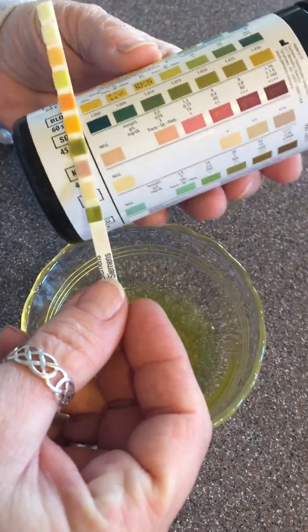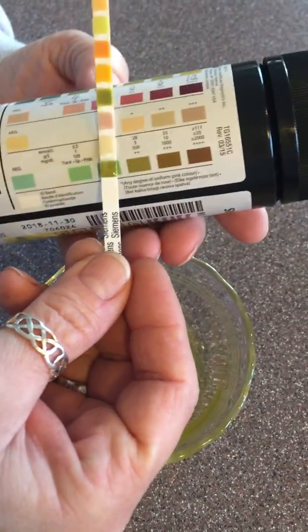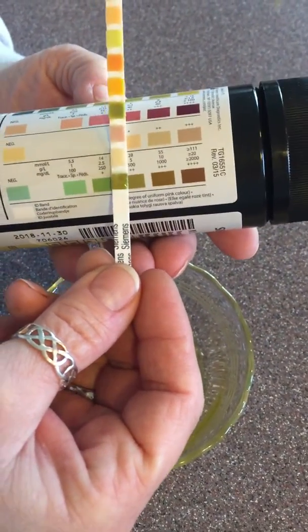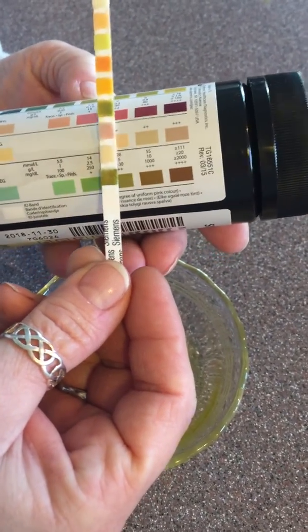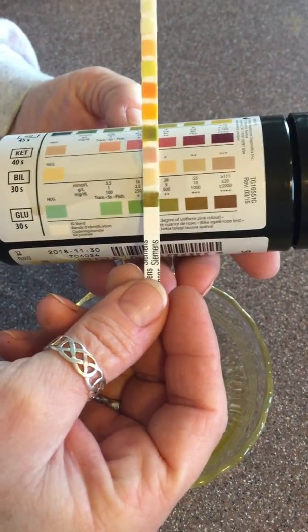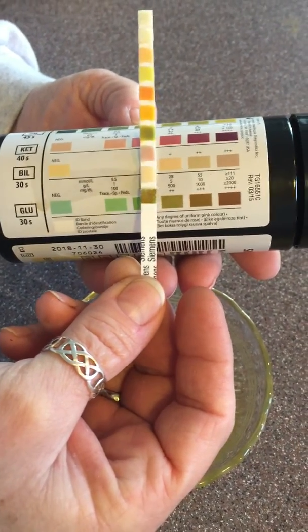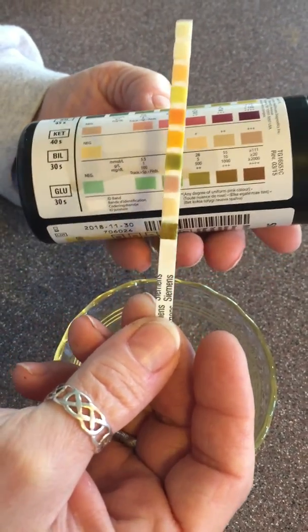So we find out what's going on, and we're actually looking for, in this case, glucose in the urine, and there it is. So we now have confirming evidence that this little guy is indeed a diabetic. Sometimes dogs that have Cushing's disease act like they are diabetics, and they're not. But there's the confirming evidence for us.